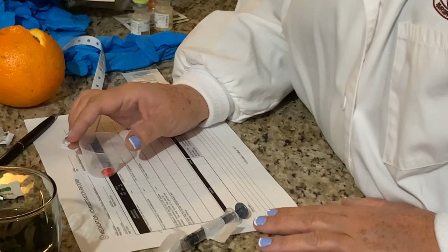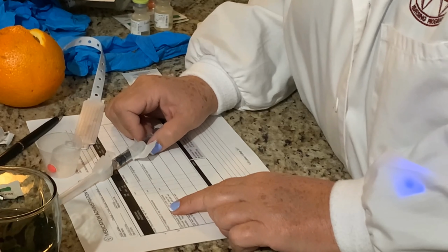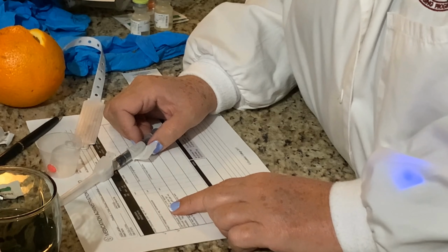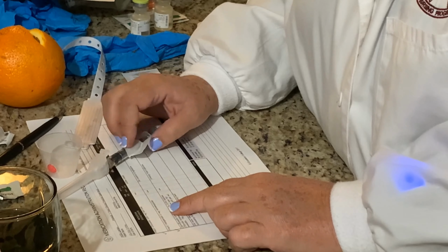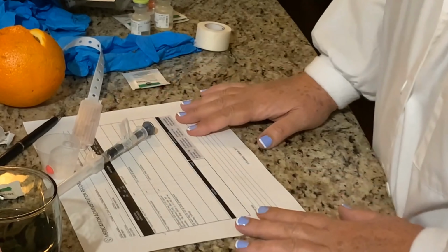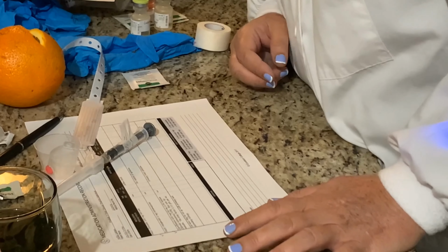So I said, okay, I'll be giving that to you by mouth. And then I also have Haldol. Haldol is just to help you with a little bit of the anxiety, help you relax a little bit. I'm gonna be giving that to you in your deltoid, which is a muscle in your arm. And it will sting just a little bit, but hopefully you won't be too uncomfortable. So that's my third check. Now I'm ready to give my medications.